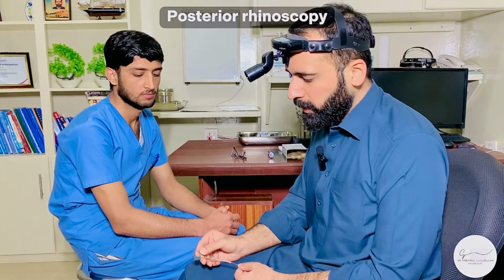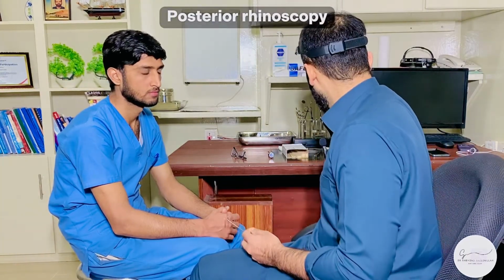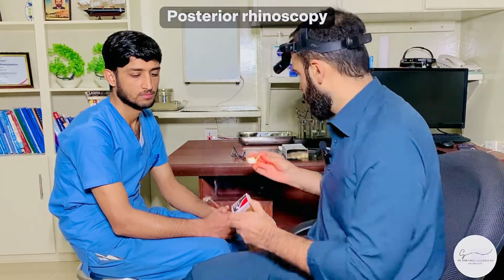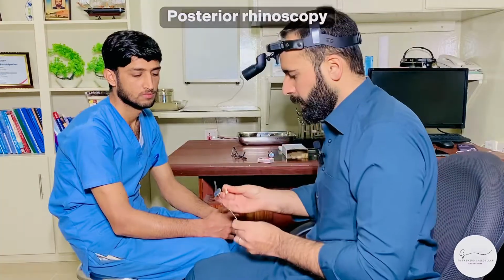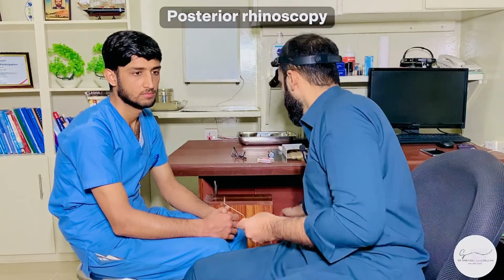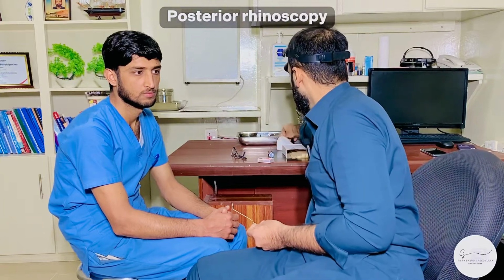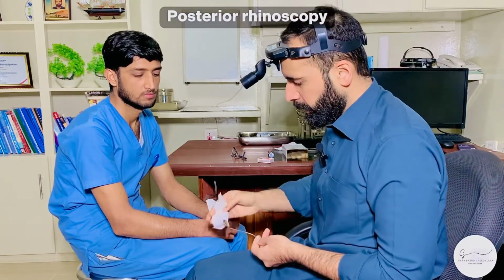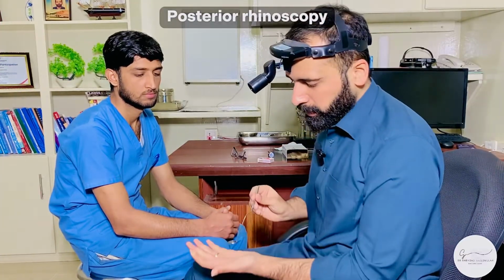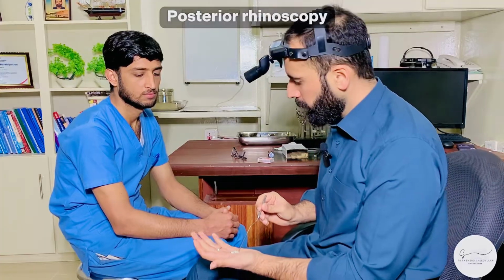We are going to heat it at the mirror end. So ideally, we should be using a lighter. You light the match up. You will gently heat it. You will take a swab. Gently clear off any fogging that may have collected. You will first see whether it's too warm to be used on the patient, and then you put it on the patient's hand.